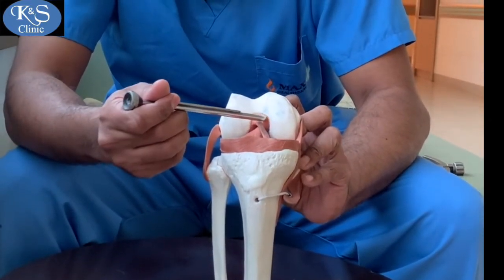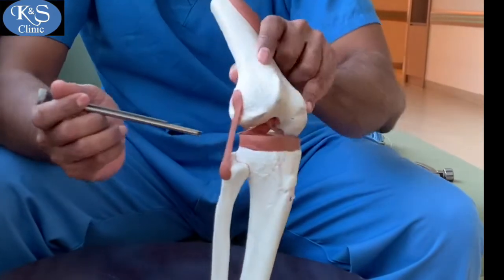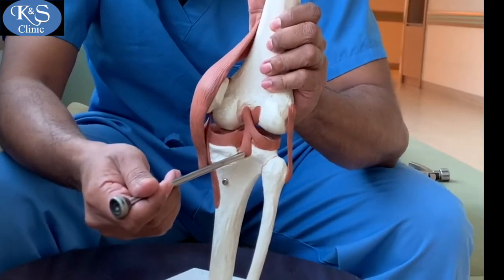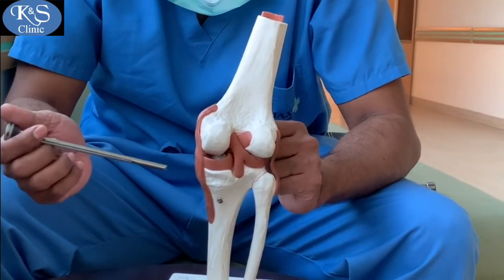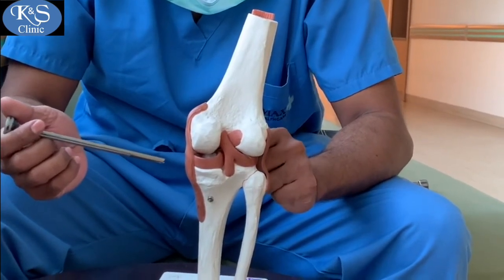The PCL takes origin from the medial aspect of the notch and goes all the way backwards, attaching at the back of the tibia almost at its center. Working at the back of the knee involves making a transeptal portal — first a posteromedial portal is made looking at the back of the knee.